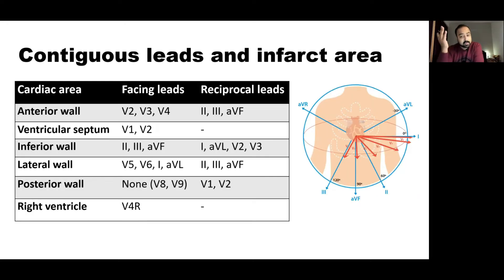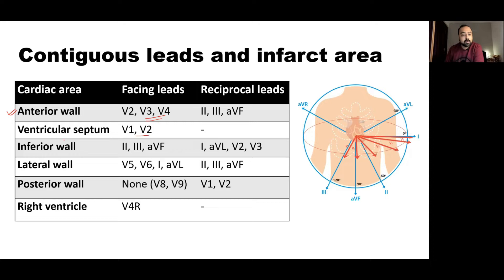If we see ST elevations in a set of chest or limb leads, we can localize which area of the heart is affected. ST elevations in V3–V4 indicate anterior wall ischemia; V1–V2 face the septum; lead 2, 3, AVF indicate inferior wall infarction; V5, V6, lead 1, AVL point to the lateral wall. Reciprocal depressions occur in opposing leads — e.g., leads 2, 3, AVF show depressions in anterior STEMI, and leads 1, AVL, V2, V3 show depressions in inferior STEMI.